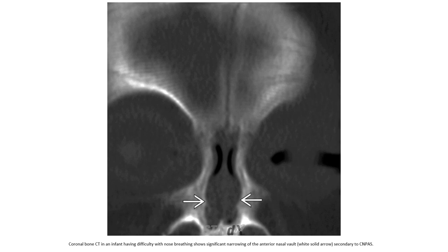Coronal bone CT in an infant having difficulty with nose breathing shows significant narrowing of the anterior nasal vault secondary to congenital nasal pyriform aperture stenosis.